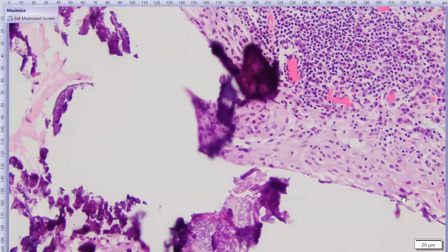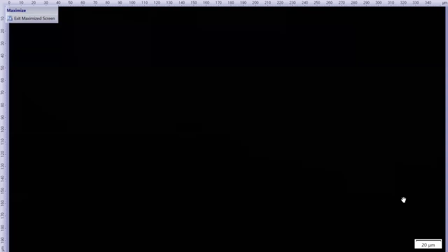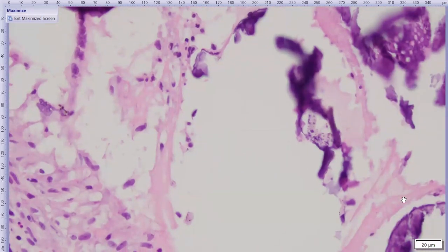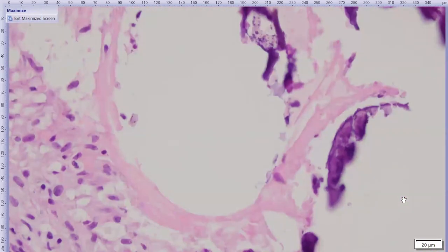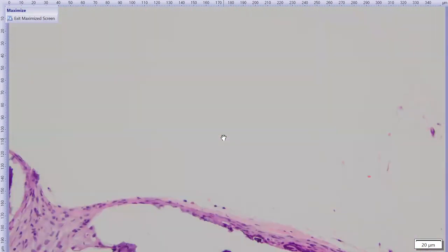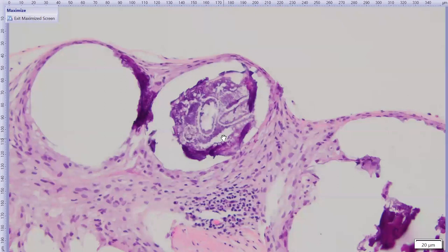And we know the most common ones we find are onchocerca. The female onchocerca has some pretty adornments to their walls, to their cuticles, which, you gotta use your imaginoscope here, but if you look around, you might see some ridges forming on the surface. On cross-section, they look like ridges, but they're more like a spiral ridge around the outer layer of the nematode. I think it helps them move around. And that's one of the classic morphologic features for the female onchocerca. And here's some mineralized, fossilized, sort of just the highlights of the organisms.